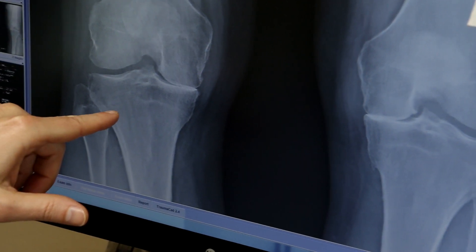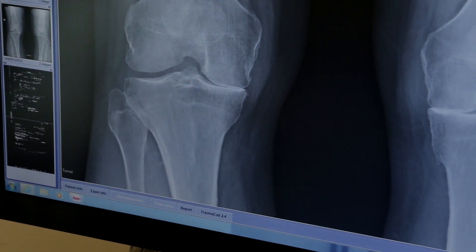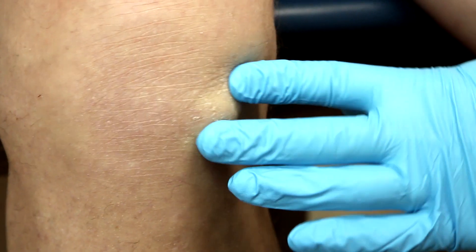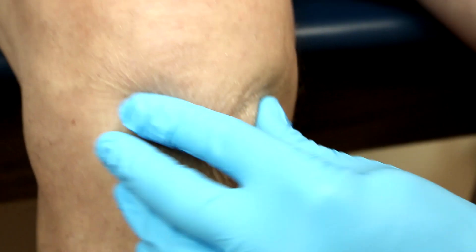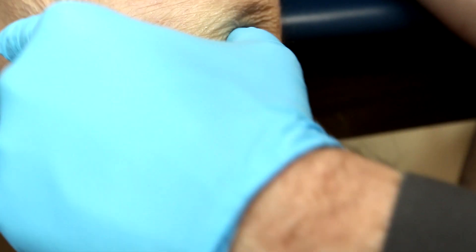So we're going to give you an injection into the knee joint space while your legs are hanging there. You happen to have — this is kind of interesting — a little lipoma or fibrous growth that's kind of in the way of how we normally would approach the knee. Let me see if I can get above it.